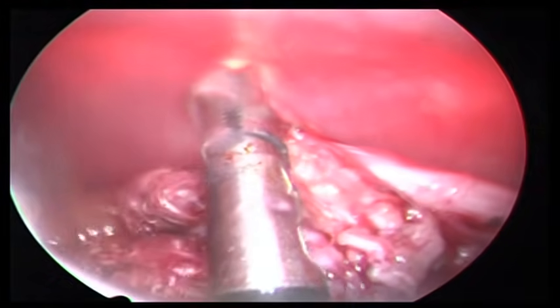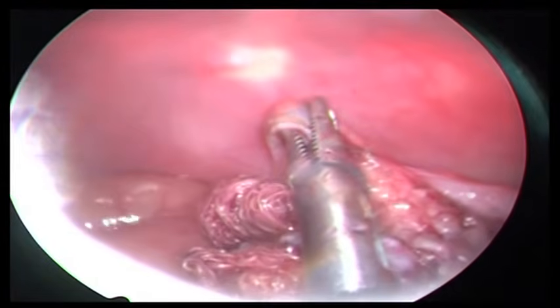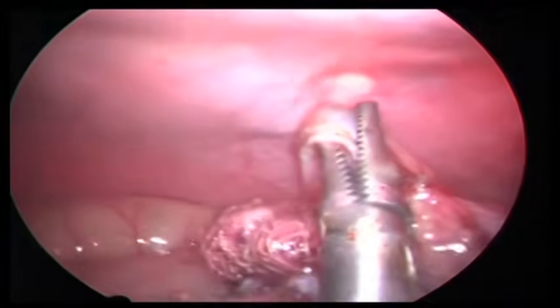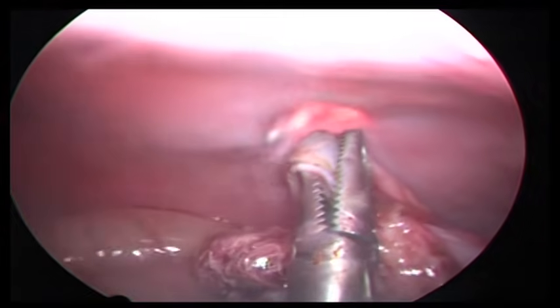And grasped the mobilized colostomy in a grasper, made an incision at the left McBurney's point, and under vision from below opened the incision down to the peritoneum.